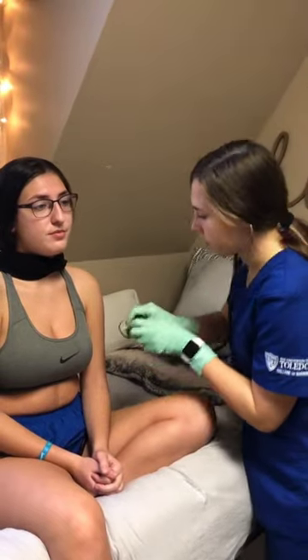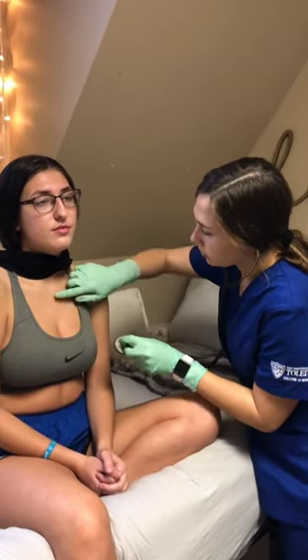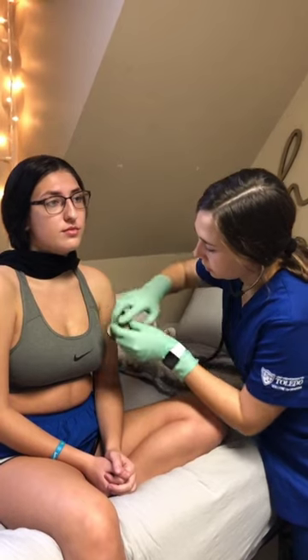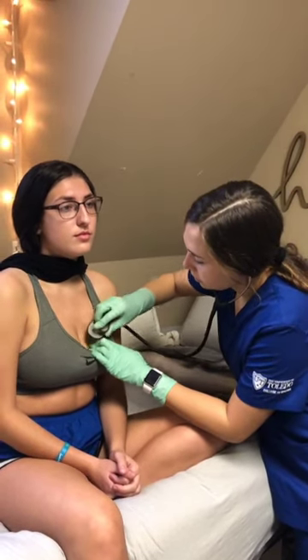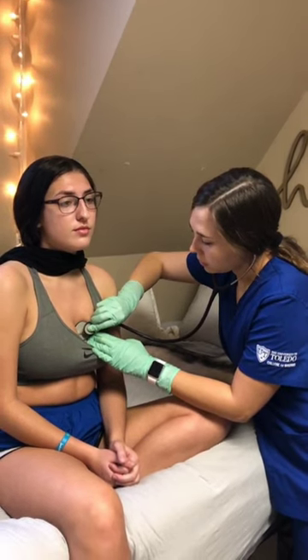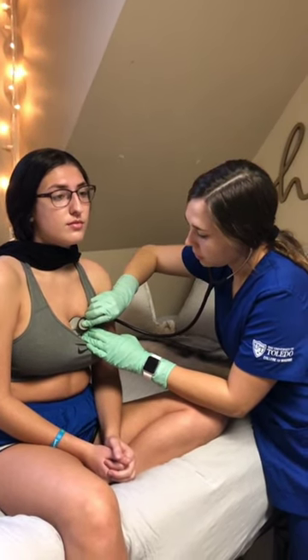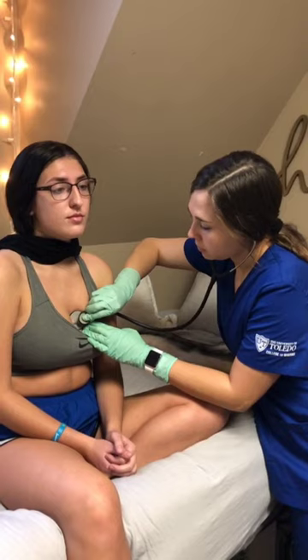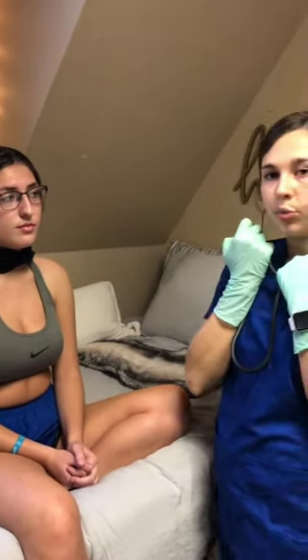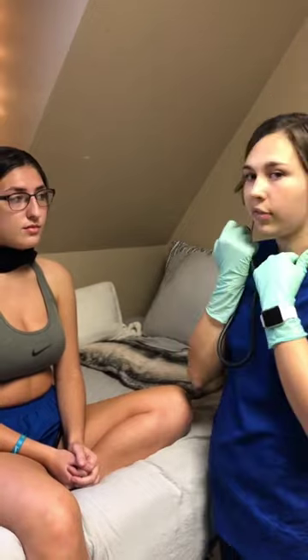Next I'm going to be moving to the tricuspid, which is the fourth left intercostal space. And lastly, my final position will be the mitral, which is the fifth left intercostal space midclavicular line.